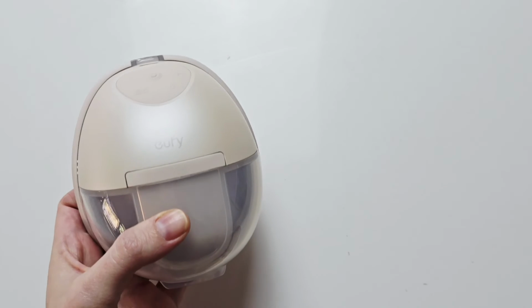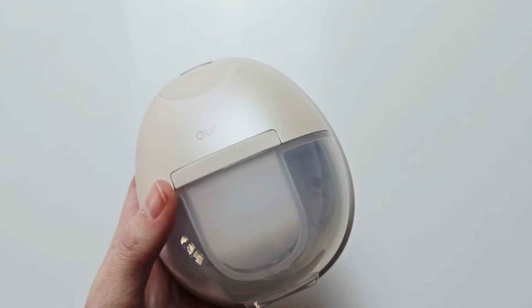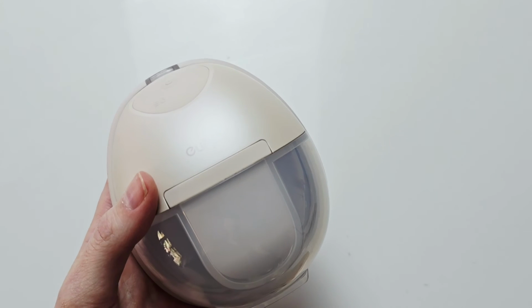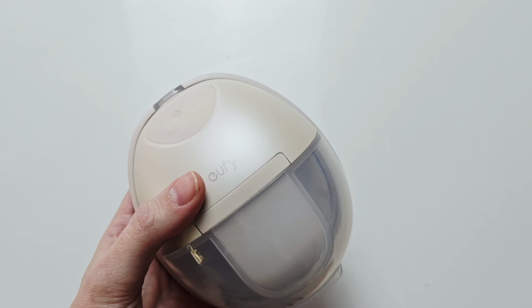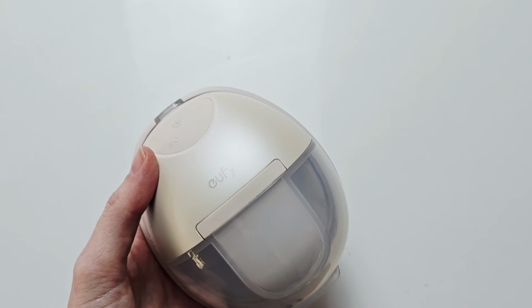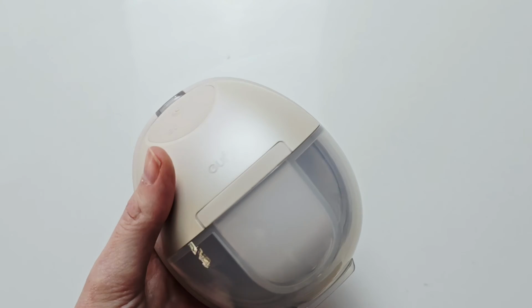So I hope this helps in how often to change your Eufy S1 Pro breast pump parts. Just remember, having your pump parts in good working order is really integral. You need to have great suction for great output. It also makes it hygienic for your baby. If there's scratches and damage, it's easy for bacteria to build up.